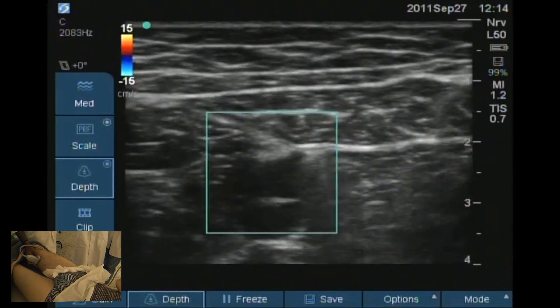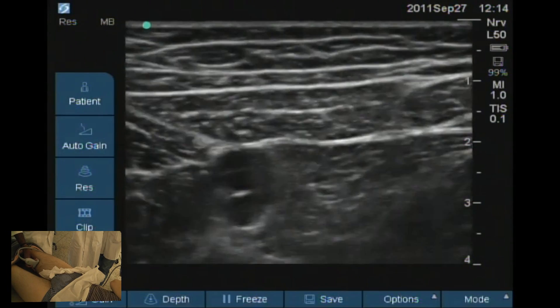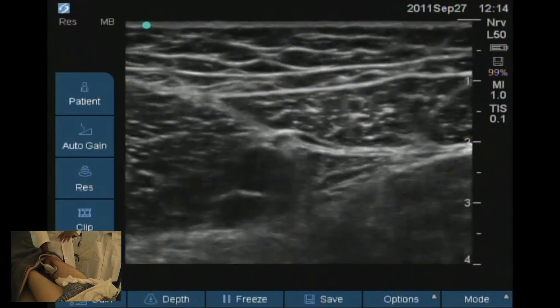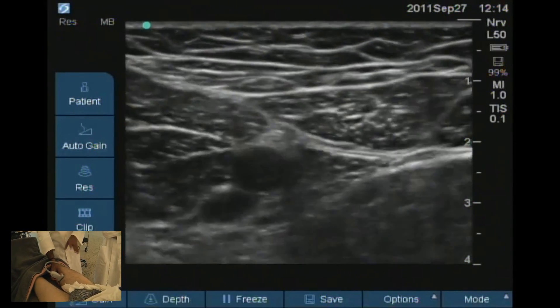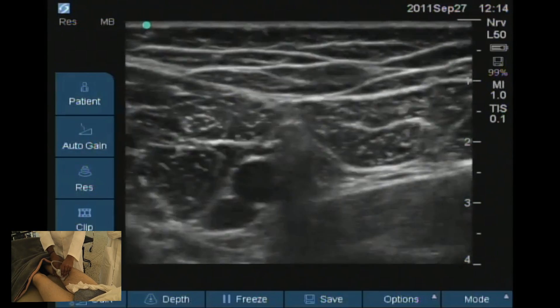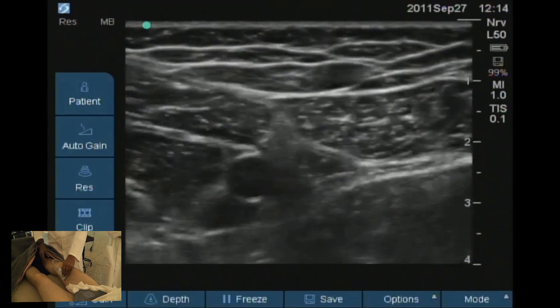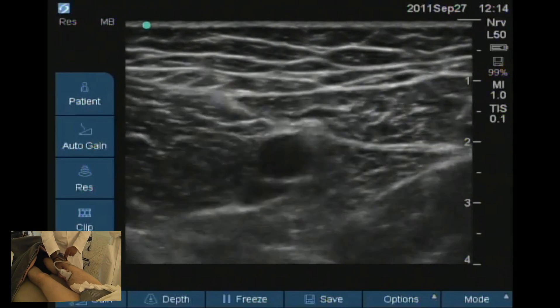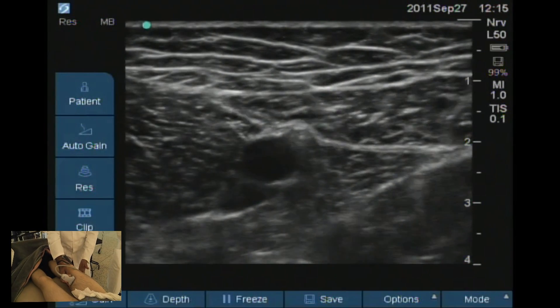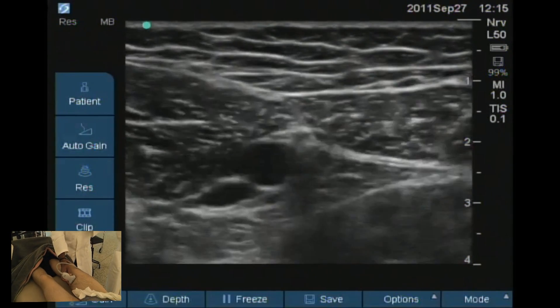It's the descending genicular artery — something that is described along with the saphenous nerve. There's an artery that is almost consistently present there. That's how we do the saphenous block. The advantage of the saphenous block is that it is a purely sensory nerve, so you don't have any of the motor weakness associated with the femoral block — you get a pure sensory block, useful for the knee as well as the ankle and the medial side of the leg. However, for bone surgery, most of the bone supply comes from the muscular branches, so if you want good intraoperative analgesia, the motor block almost goes with it.